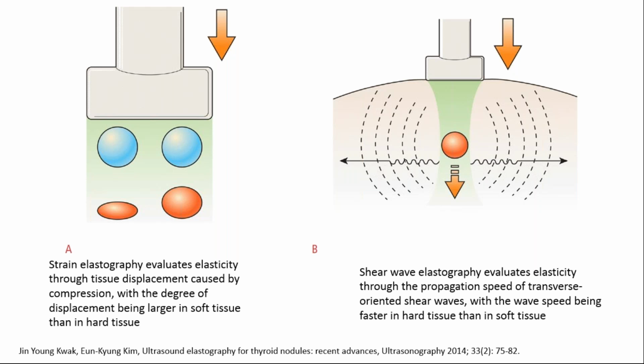Now, if you combine elastography with that, you can also see the regions where there are changes, or which are losing elasticity, or there are changes in the mechanical properties of the tissue. And sometimes you can see that even in early stages. So even before you see much of the changes, you can pick up with elastography.